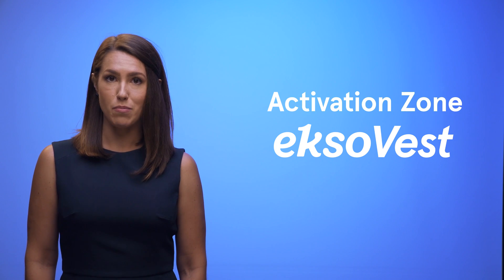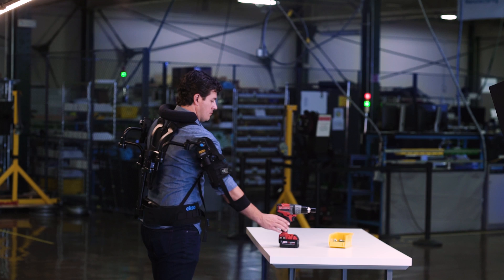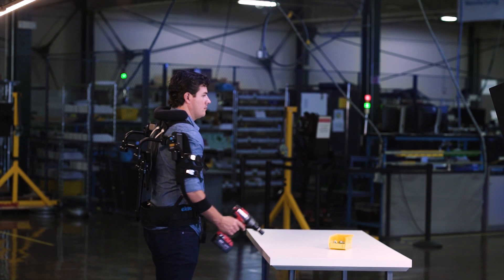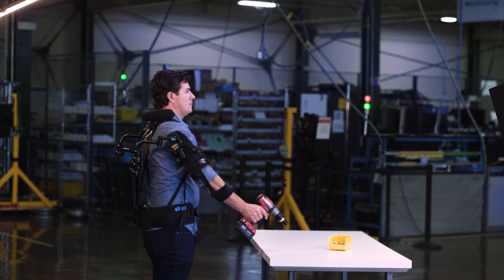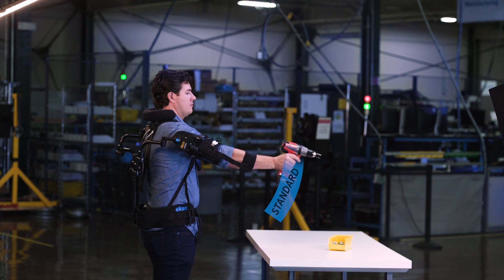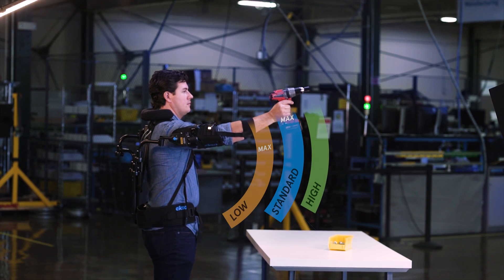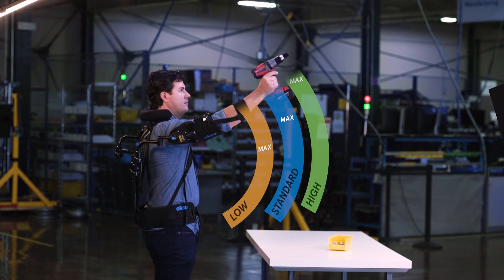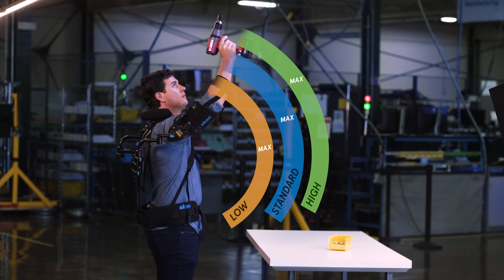Your ExoVest provides support only when you need it. You can relax your arms at your sides without fighting it. As you raise your elbows, you'll feel the springs kick in — this is the beginning of the activation zone. You can adjust the activation zone to have support kick in higher or lower, but the standard setting is recommended for most applications.